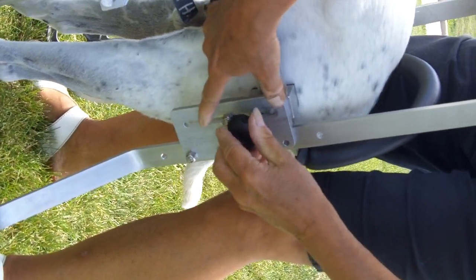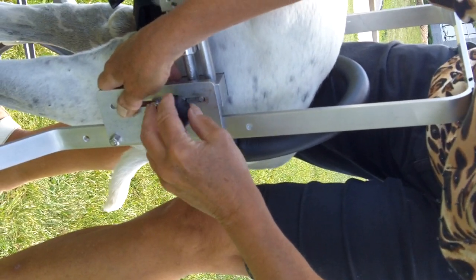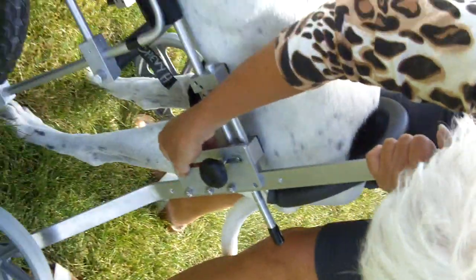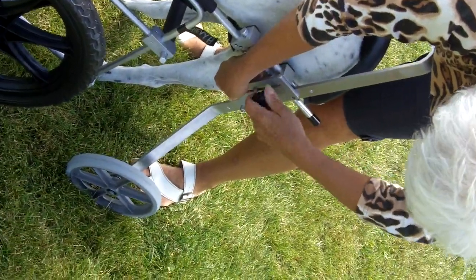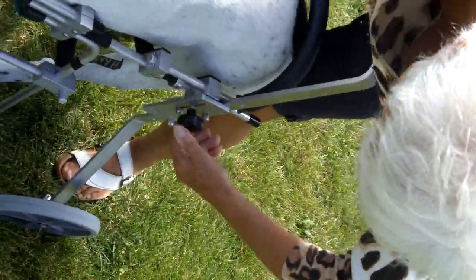But as you see, you have the ability to put this in crooked because there's nothing guiding me. And so you've got to really just be gentle about it. It's sliding and now it's tight right now for some reason. Which if I kept pushing, I would strip it.